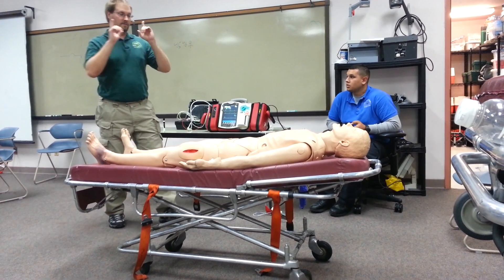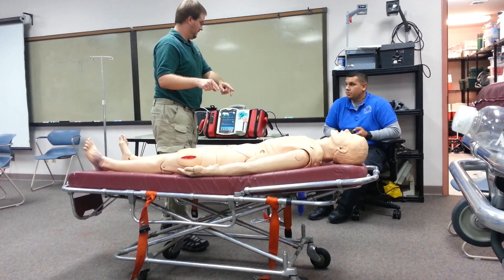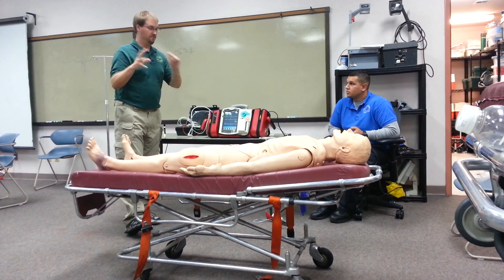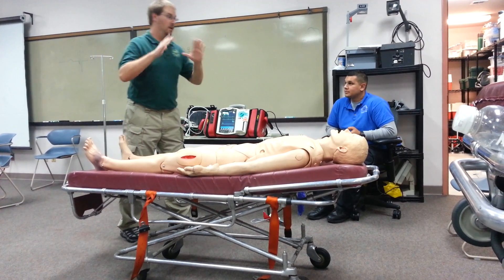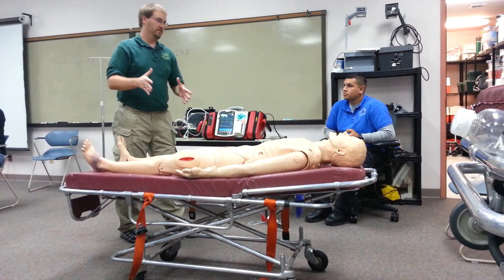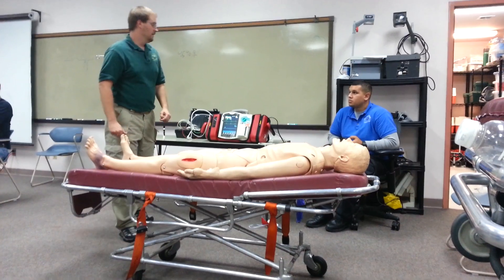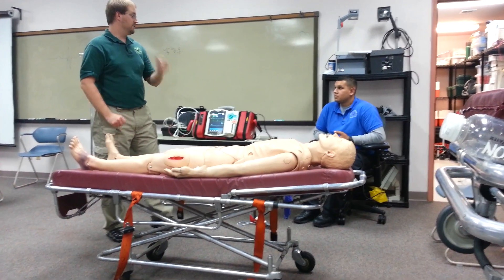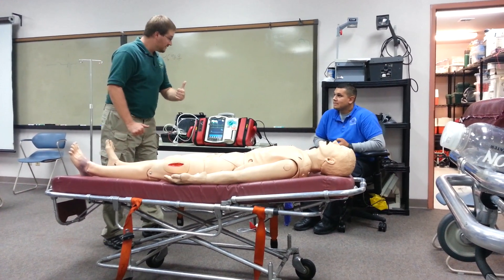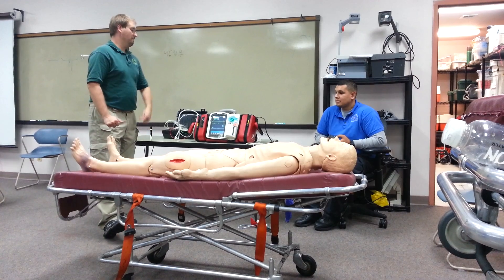We have a pulse. Is the patient showing any signs of alertness? Yes, she is becoming more alert. Is she tolerating the airway in place? Yes. If the patient becomes alert and anxious, let me know and we'll get some meds on board to make her comfortable. Now that we have return of spontaneous circulation, consider therapeutic hypothermia protocol. Let's load and go. Continuously reassess the patient with full sets of vital signs at least every five minutes. If vital signs remain unstable, consider administering a vasopressor infusion.